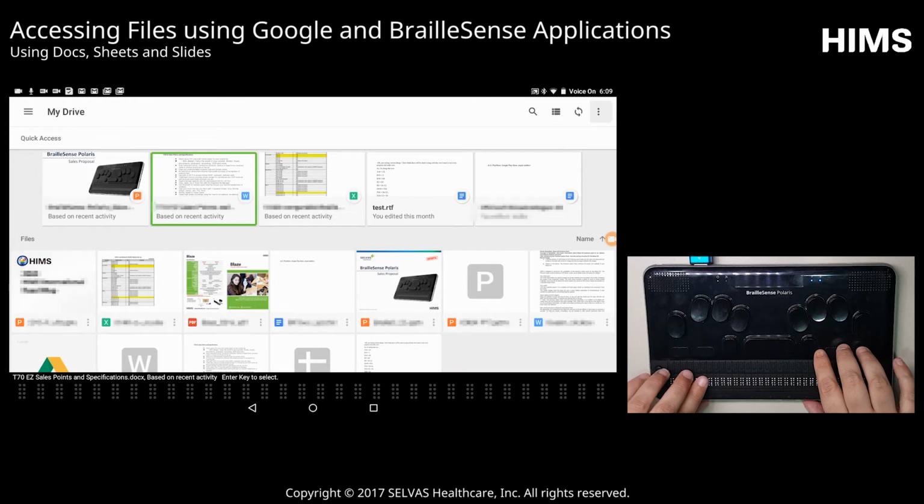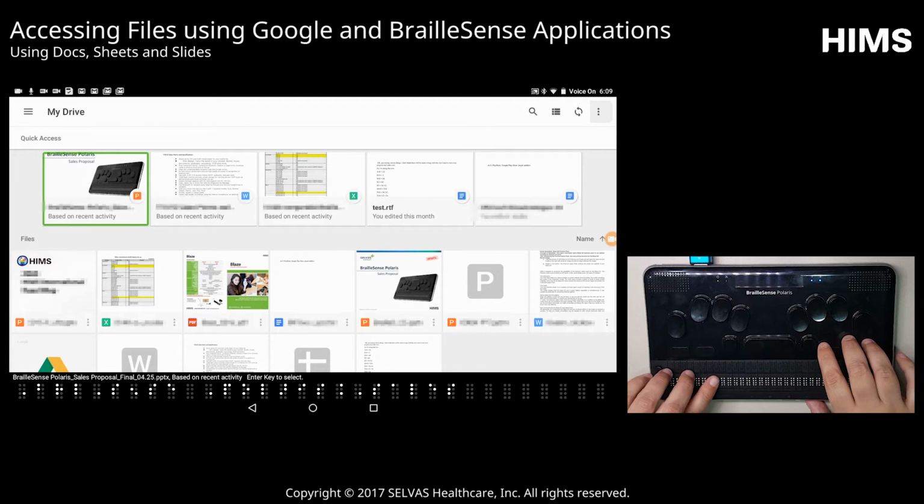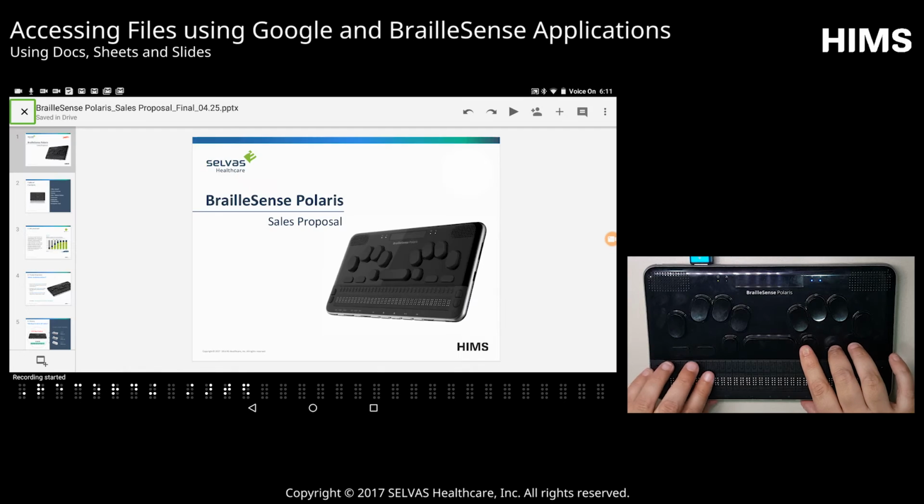And now I'm back in my Drive, and I'm in my file list. Now I'm going to go back. BrailleSense Polaris sales proposal final 4.25 pptx, based on recent activity. And I have a PowerPoint here, so I'm going to press Enter to open this in Slides.